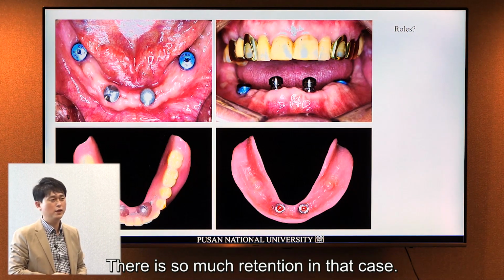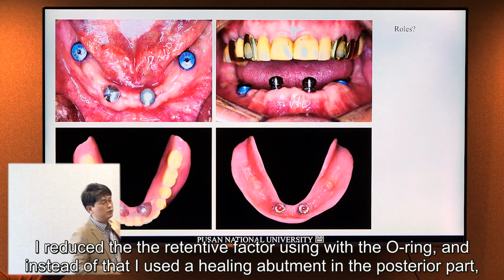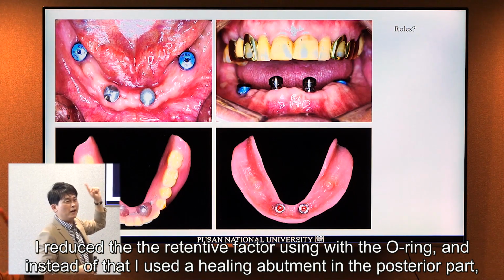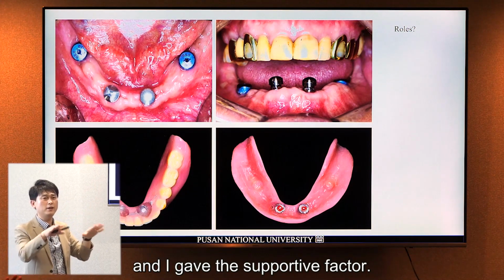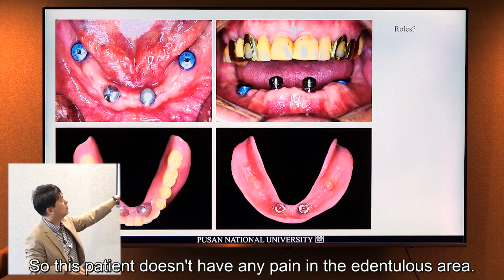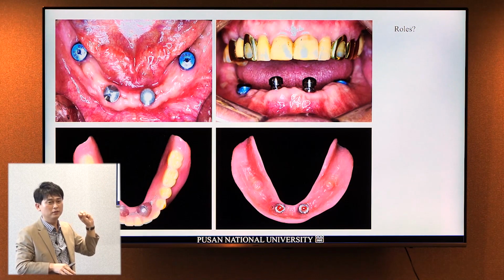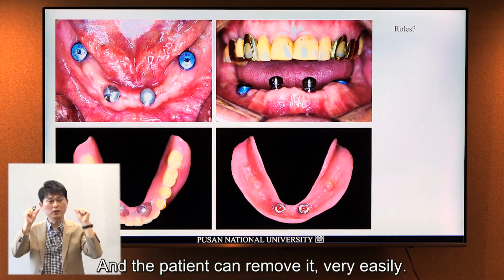There is so high retention in that case. So I reduced the retentive factors using O-ring, and instead of that, I connected healing abutments in the posterior part, and then I gave the supportive factors. So this patient doesn't have any pain in the edentulous area, but the patient can remove it very easily.